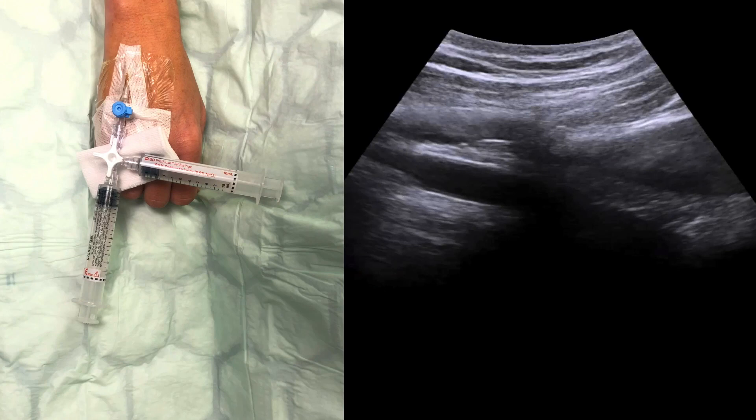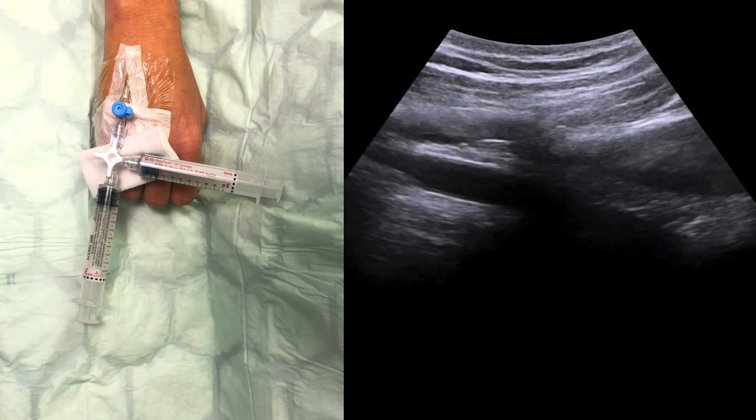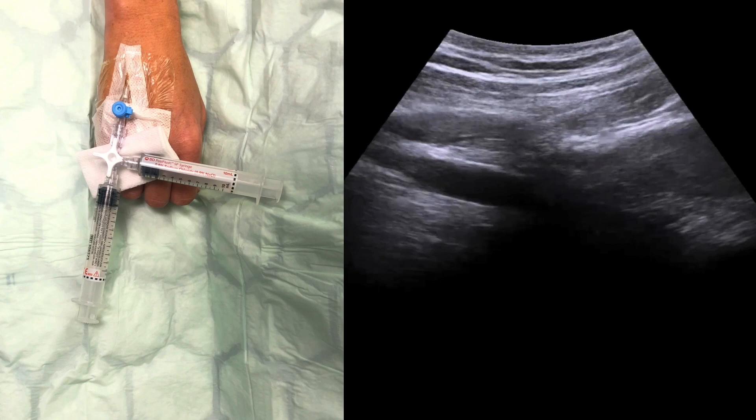See the flow of bubbles in the subclavian vein. At this point you have to ask yourself: have you identified the vein? If you're absolutely positive, scrub up and cannulate. If not, choose another site for your line or call for help.